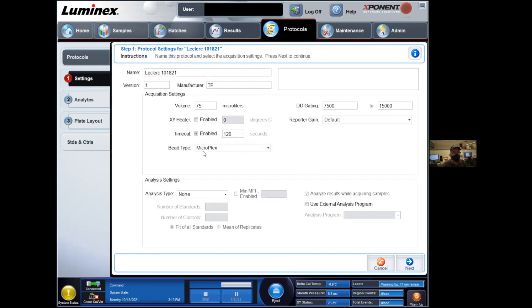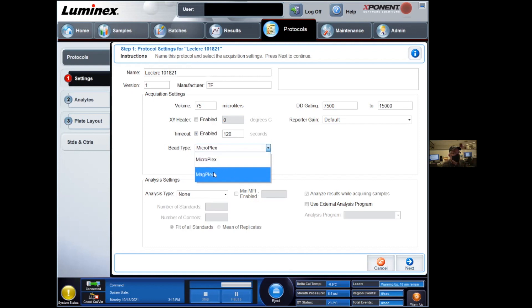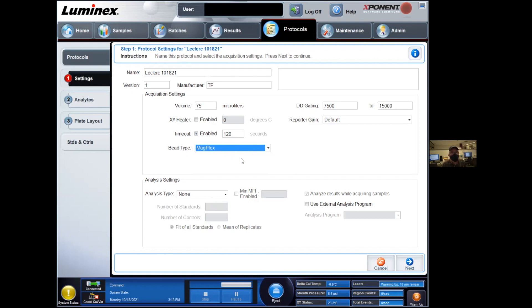Bead type is a very important one. For whatever reason, microplex is the default value. I think it's a bead that is discontinued now. It's a smaller particle and basically this is telling the software what voltage to use to identify the beads. If you do not select the right beads, which are typically the magplex, the bigger ones, the magnetic beads, the settings on the instrument might be off and you won't be able to measure your experiment properly. So this is a critical thing that you need to be aware of.